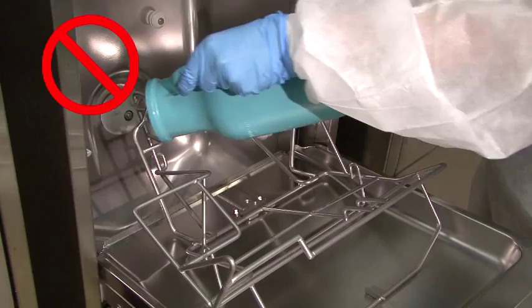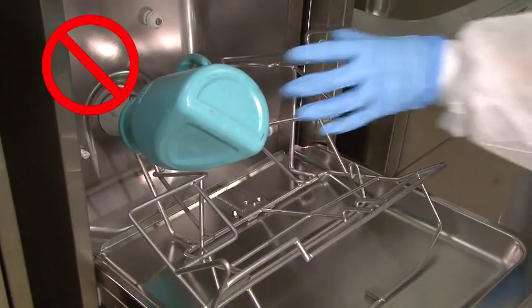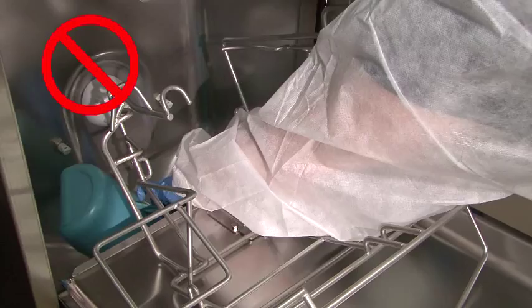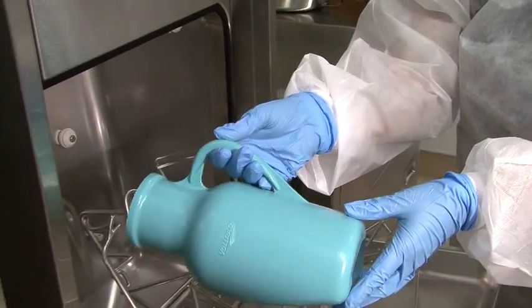Do not make this mistake. When the door closes, the urinal could slip off the rack and jam the door shut. Always load the urinals the correct way.